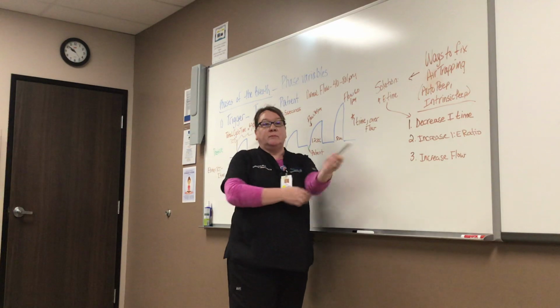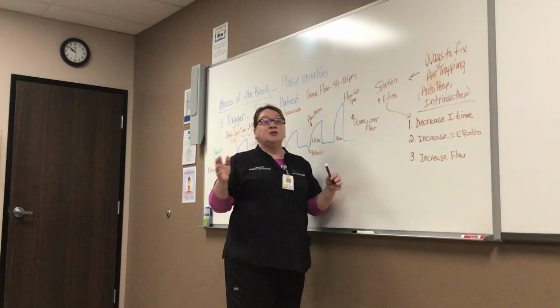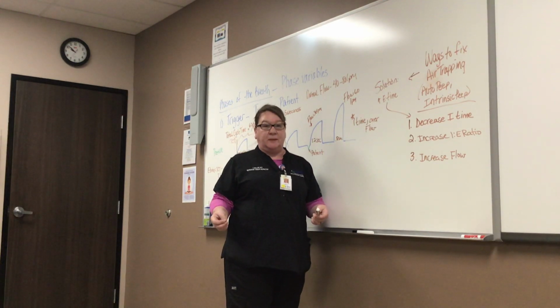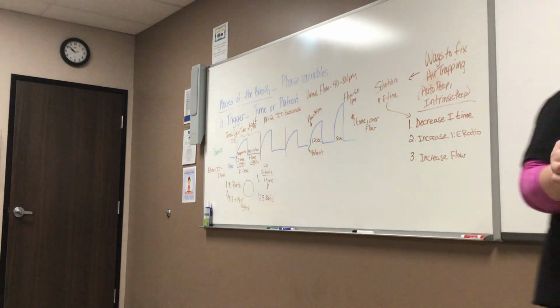But previous to that, you said a phrase, if flow is too low, then. If you increase the flow, you will decrease the eye time. No, I said if the flow is too low, you have to be careful because it could take too long to get the breath in to deliver the volume that you want over a certain amount of time. Okay, thank you.